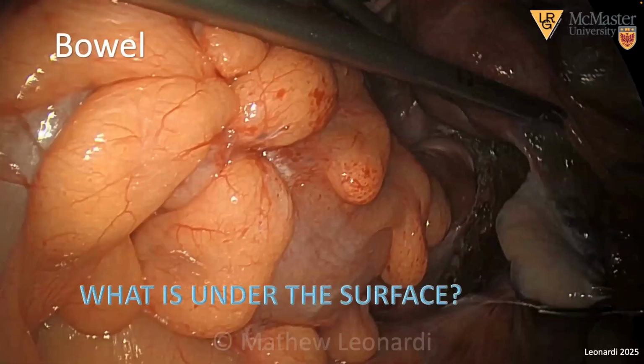So now, with my time remaining, I'm going to take you through how to do some of this in a really high-yield fashion. And I try as best as possible to, in particular, use surgical footage for the imaging audience, the sonographers and the radiologists, because I think it solidifies how this disease can look to us in a different way. So here we have the sigmoid colon, and I'll point you to this particular area where I say what is under the surface. You see there's a little blue area here, a little bit of red. Maybe these epiploica look like they're kind of stuck to each other. Overall, not particularly concerning in appearance.